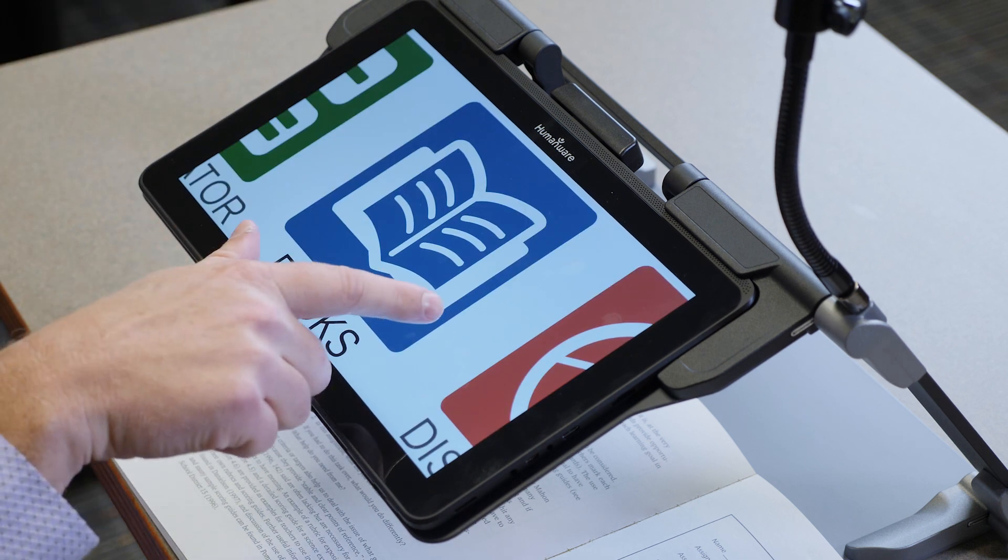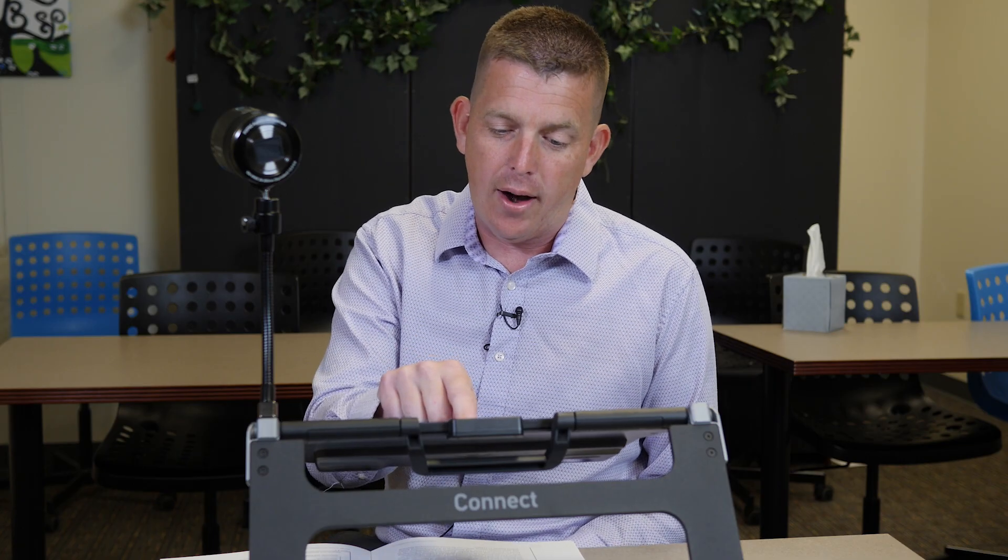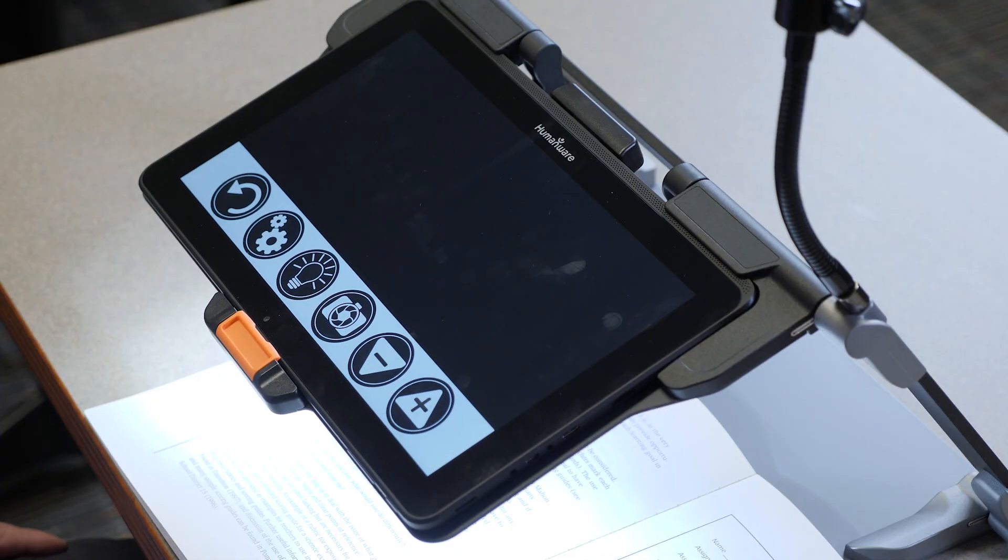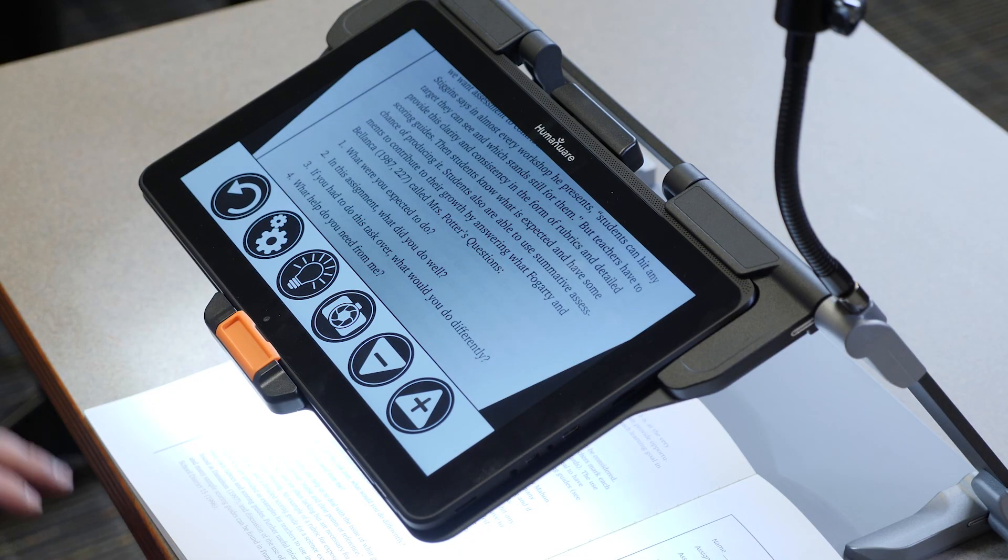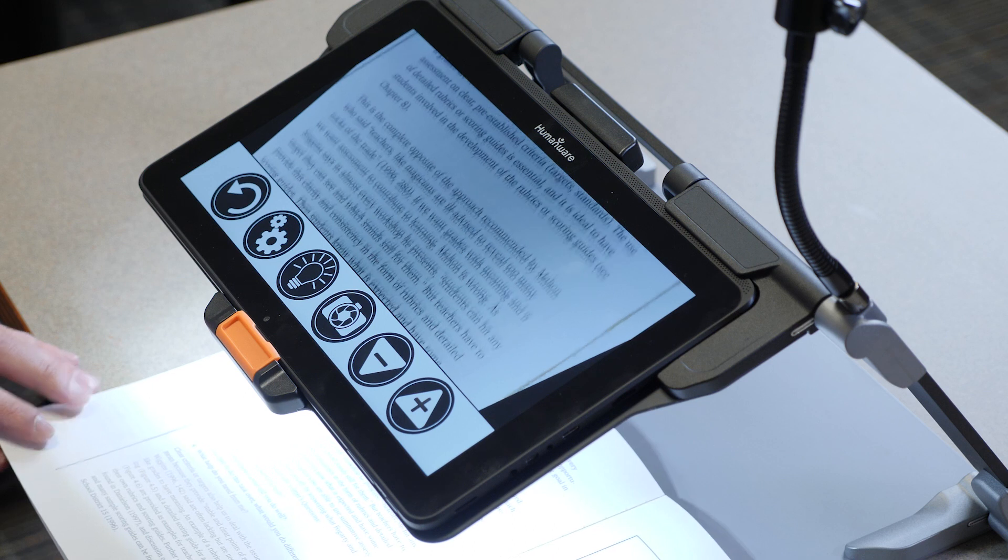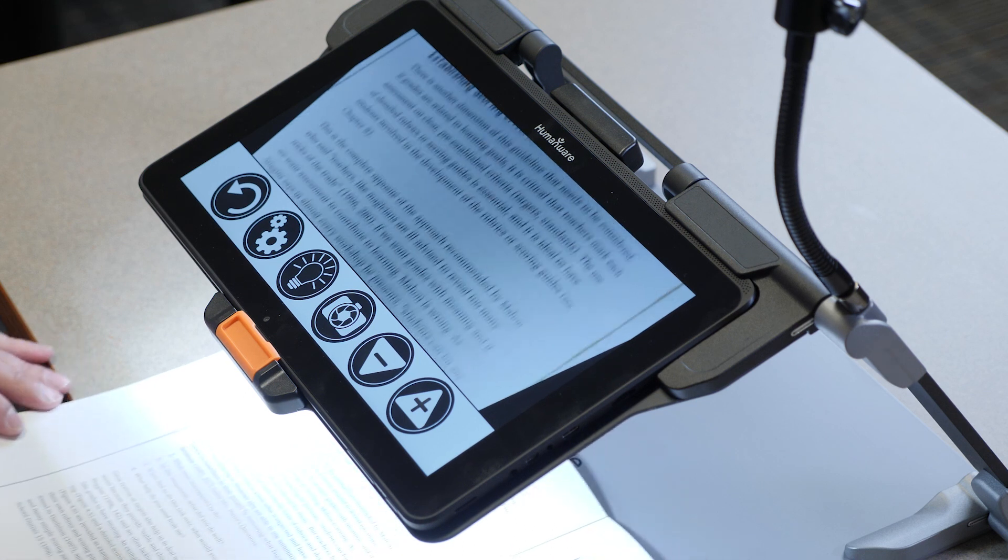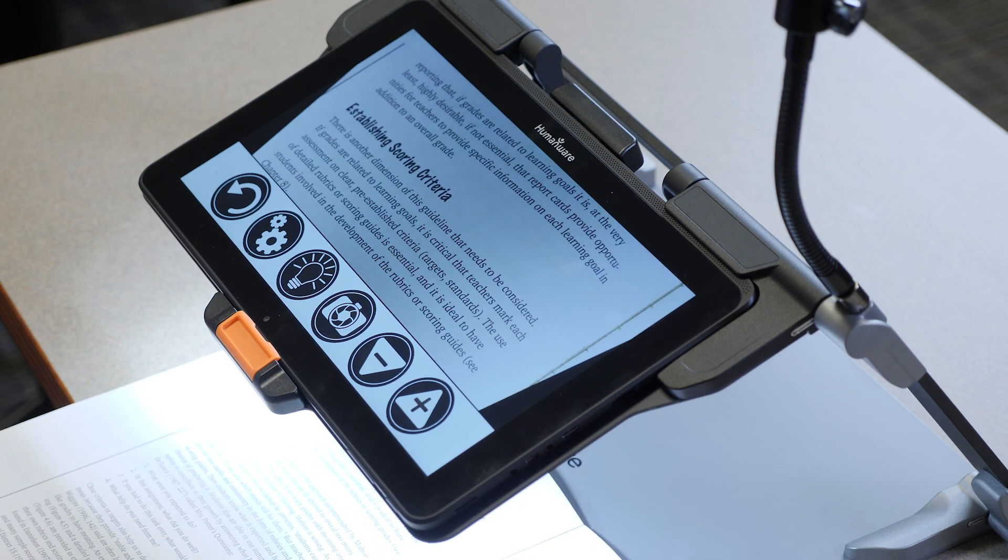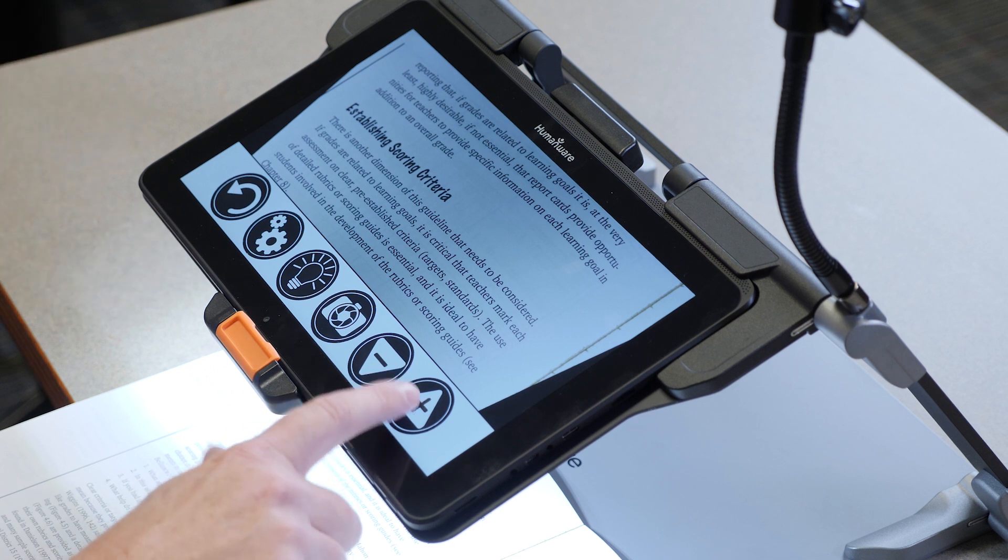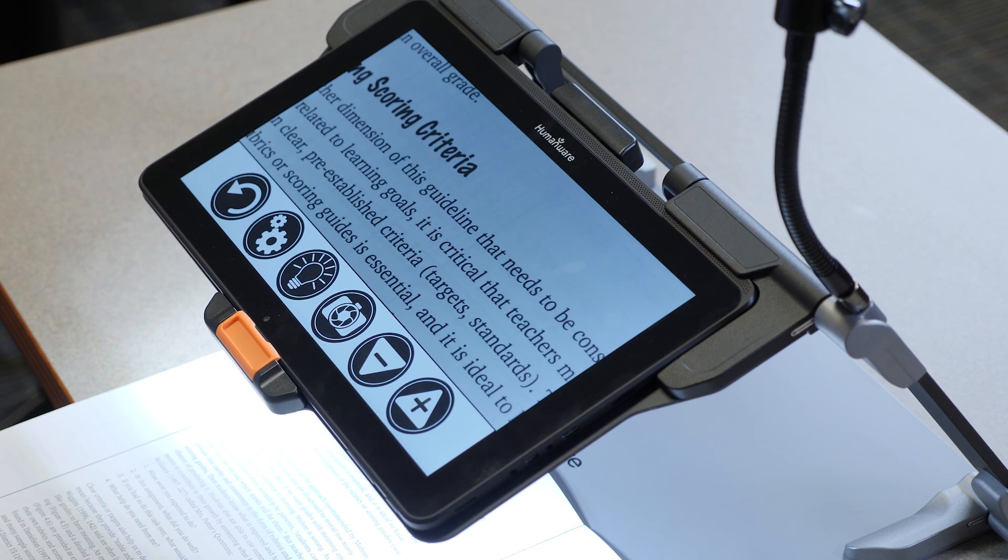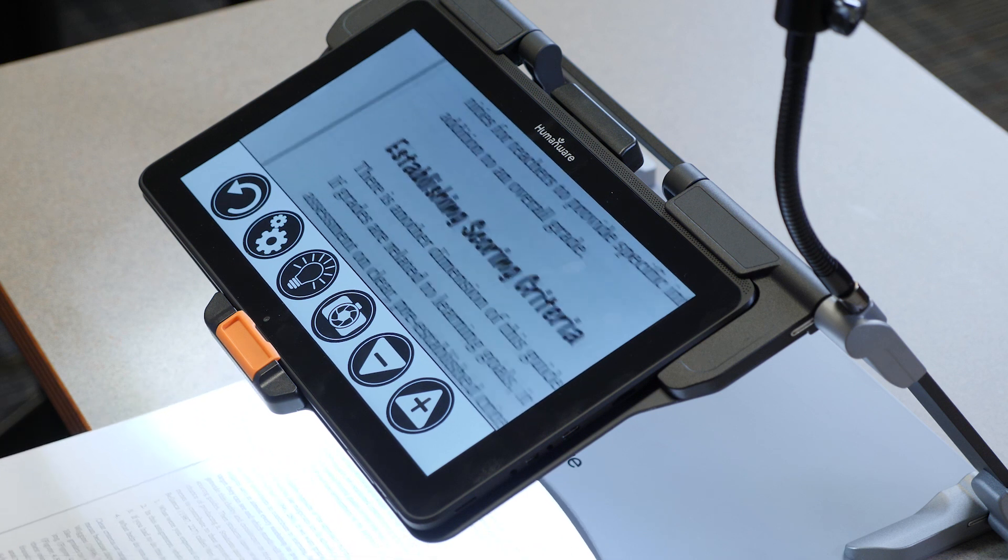Then we're going to look at the magnifier application. The magnifier application gives us a full video magnifier. And with this we have a high definition camera as well as a high definition screen. And we can make this as large as we need to for our students to read in a live mode.